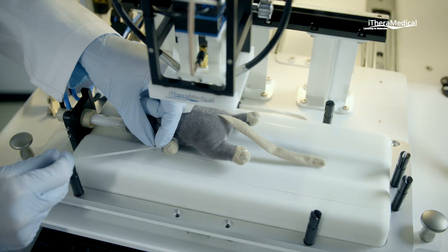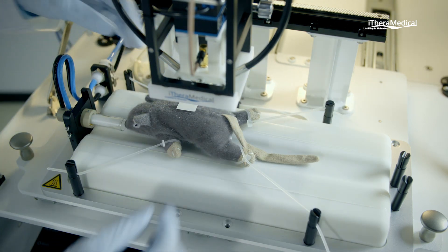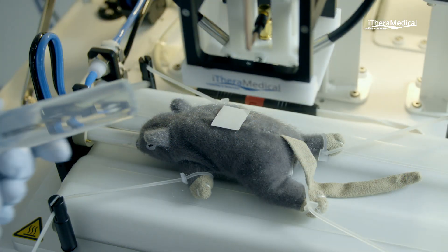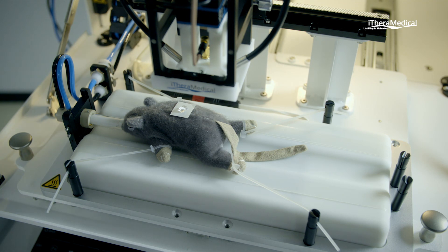Loose-fitting cuffs are attached to the paws of the animal, allowing immobilization through attachment to the holding posts as needed. A drop of ultrasound gel is applied to the animal's skin to facilitate coupling of ultrasound signals.